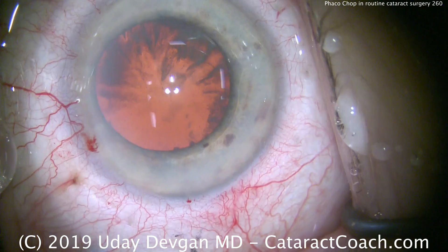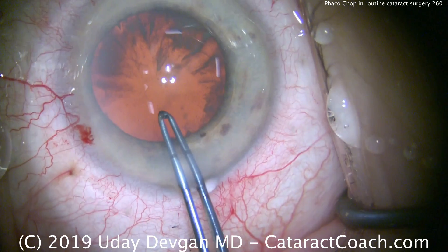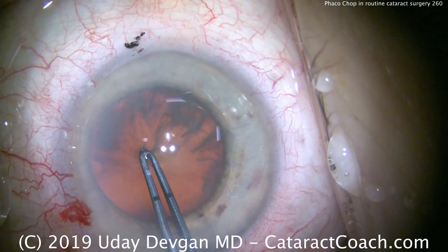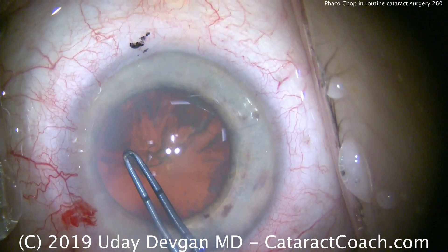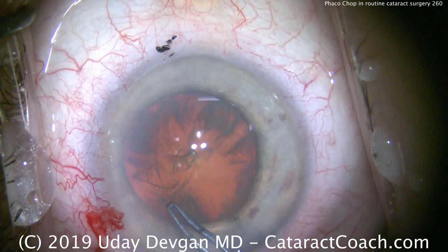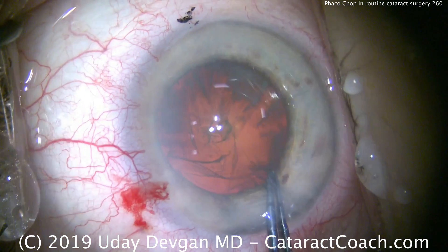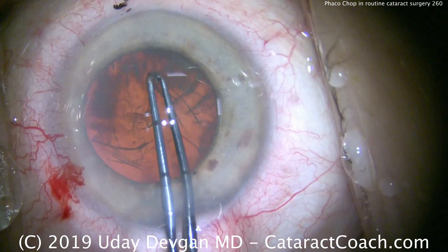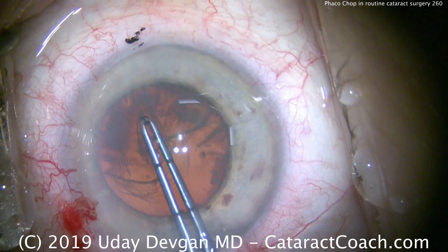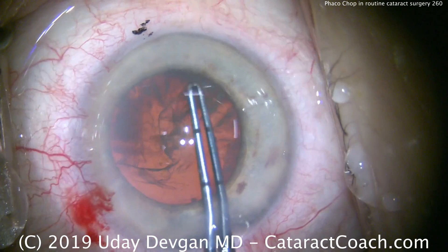With a small corneal diameter, we need to make sure we have a good capsulorhexis. We adjusted the microscope lighting so we can see better. There are the forceps — you can measure out how big we have to make this rhexis. In this eye, it's going to be just right up against that pupil margin, so while this may seem initially like an overly large capsulorhexis, it's actually going to be just about perfect.